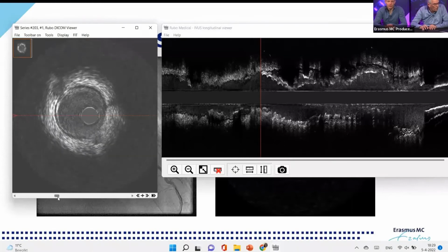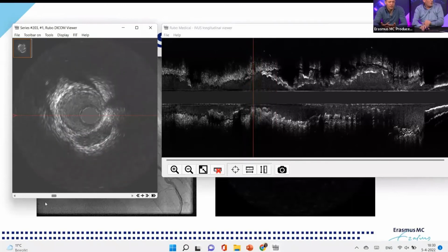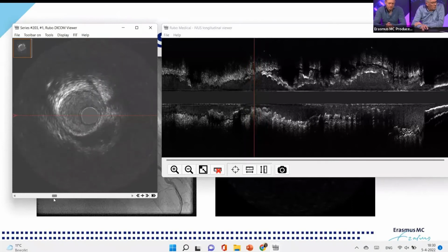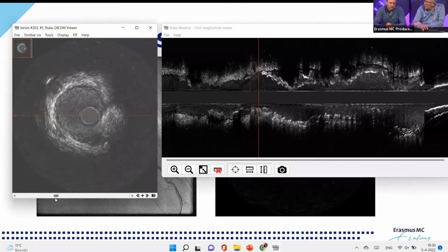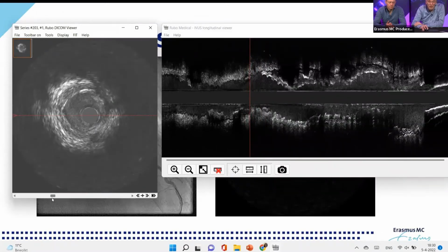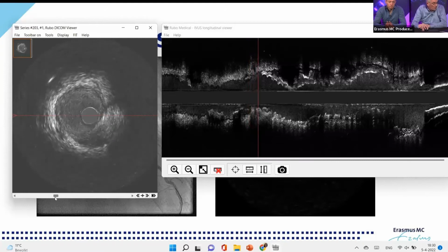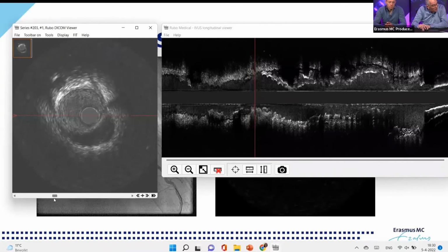And also more often in areas where there is still edge disease. In this case, the stent edge was actually positioned perfectly because it is in a very healthy reference segment. But still, indeed, there is... if we can look at the angiogram again later on, if we can see something at the edge of the stent. Sometimes you can even appreciate, but I wasn't there during the procedure. They can have extravasation. We really had some discussion about that, but I think that we have a hematoma outside the vessel in there.